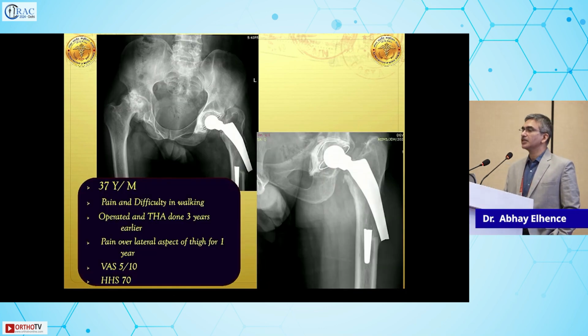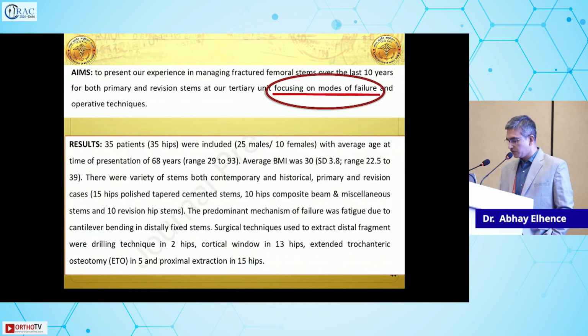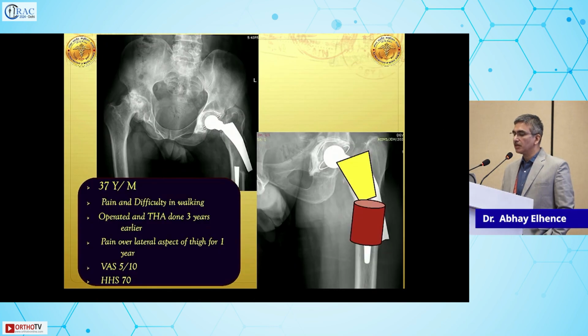Metaphyseal deformation, we will see a lot of these. So the first message is choose your stems wisely. Don't just put in something because the patient cannot afford it. You try and justify the cost of a decent implant for your patient.